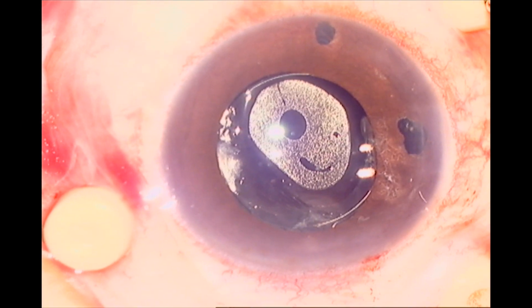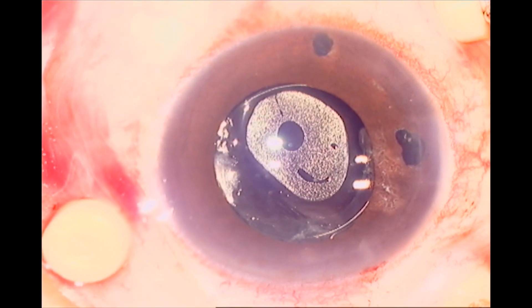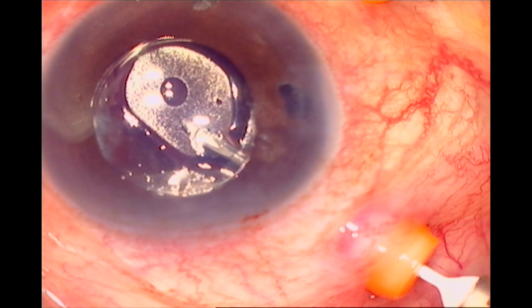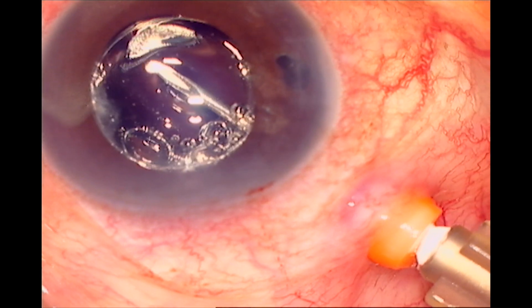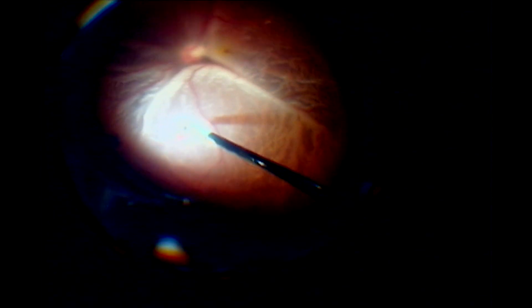This problem can be tackled by injecting viscoelastic between the air bubble and the lens, as seen here. With the 26-gauge needle through the 23-gauge port, I am pushing viscoelastic, thus moving those bubbles away from the intraocular lens and clearing the media. The viscoelastic effectively coats the intraocular lens and prevents further fogging.